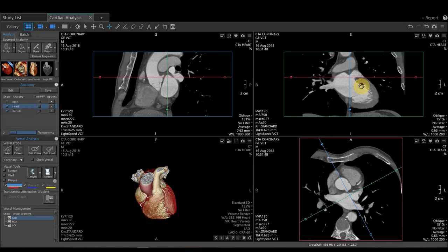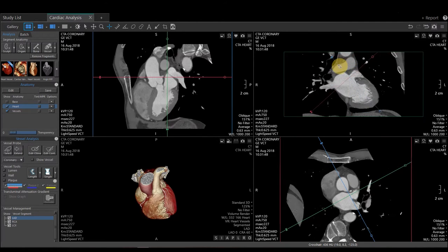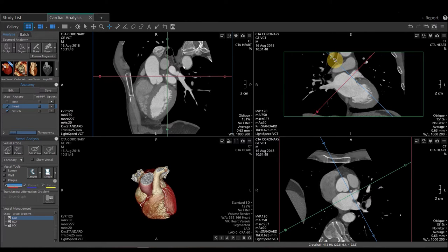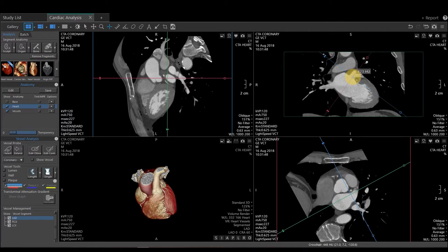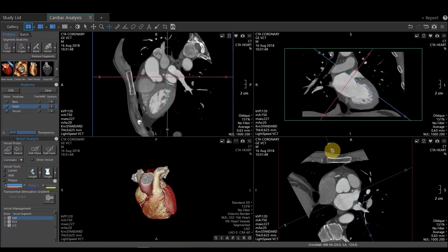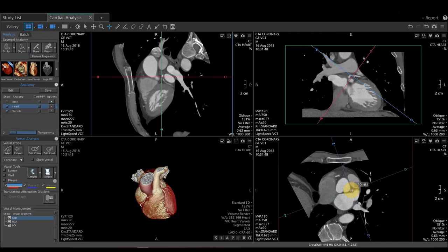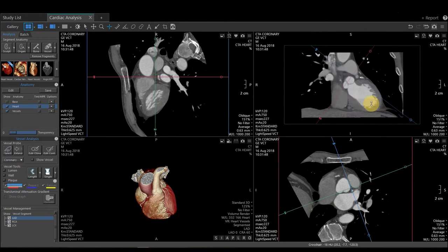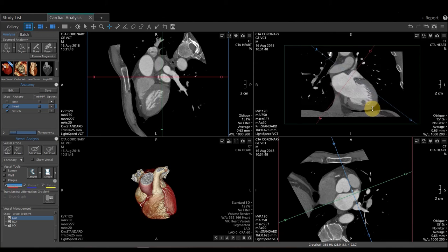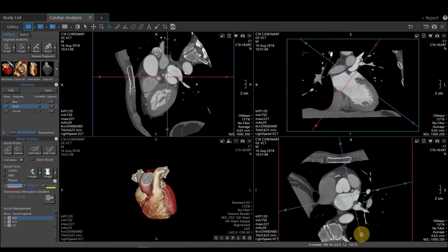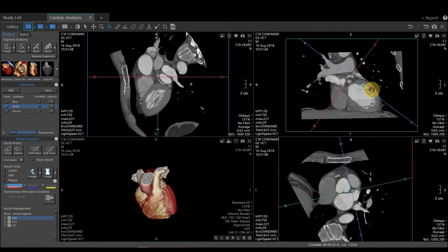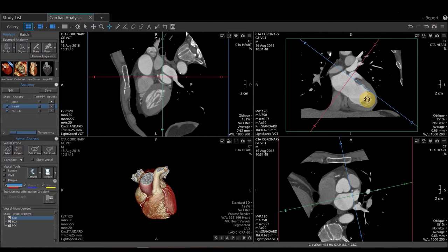I'm then going to come up to my coronal image and do the exact same thing. This will be creating my double oblique. I'm going to make sure that I get it right in the area I need it. So once I'm in plane, I can go ahead and start my measurements.